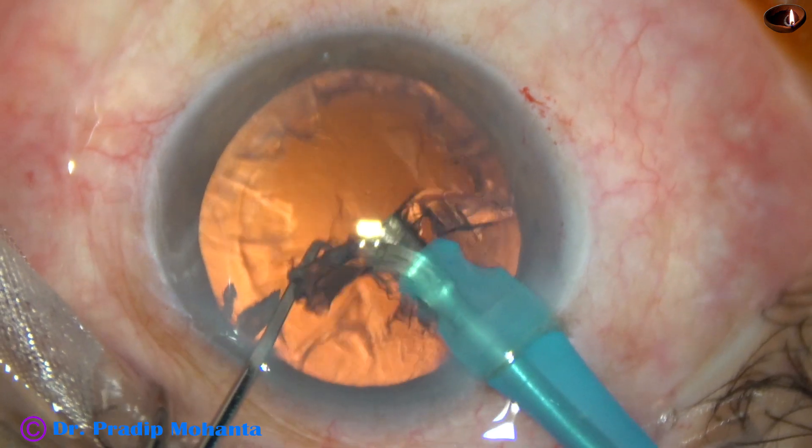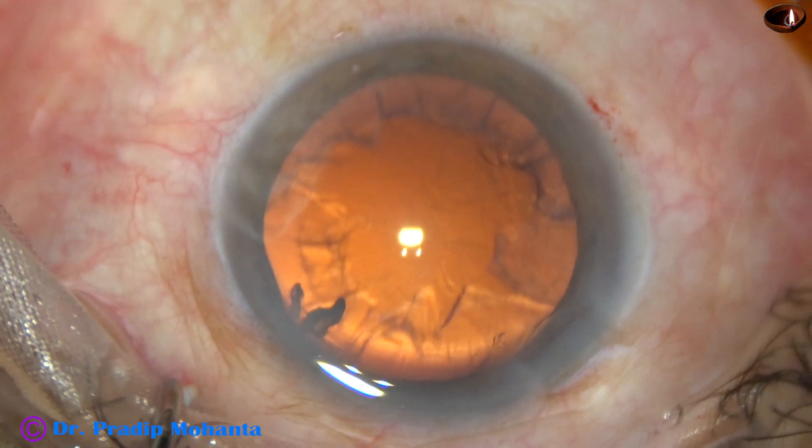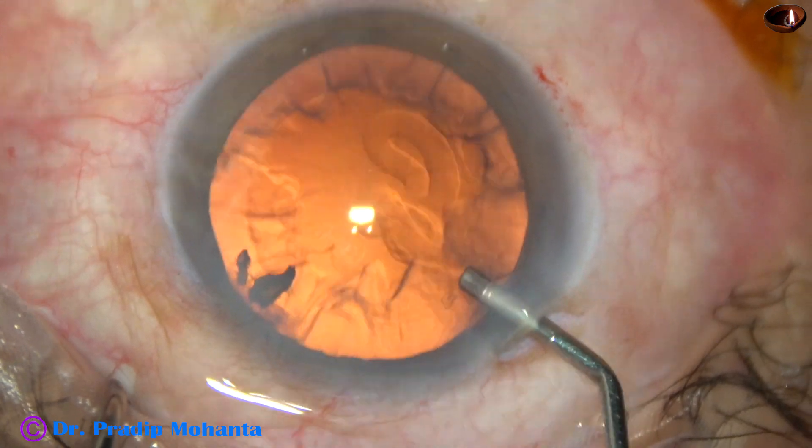Now the epinuclear sheet is being removed. At this time I am in FACO 3, that is low vacuum, low energy setting.